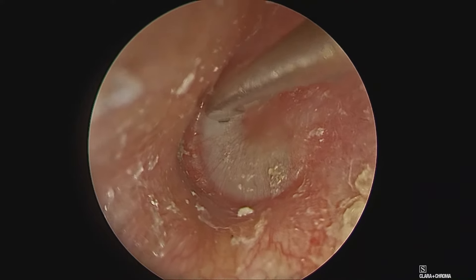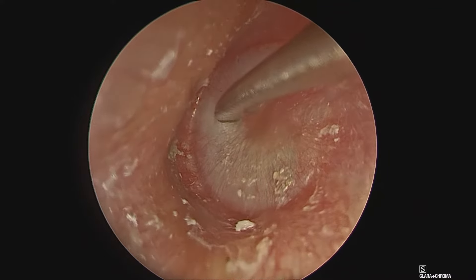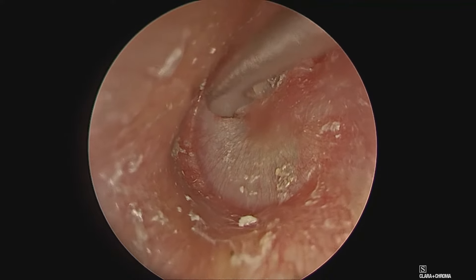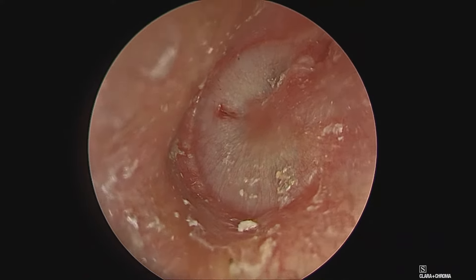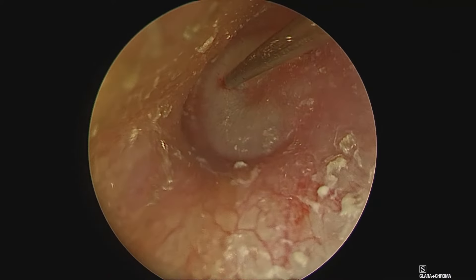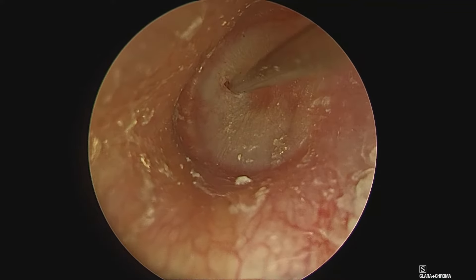You would have appreciated that the tympanic membrane was dull in picture with the absent cone of light, but here for a surprise it is a dry tap — there is no fluid on giving an incision. This happens when the patient has been taken under general anesthesia, sometimes because of pre-operative bag-mask ventilation which may have displaced the fluid from the middle ear through the Eustachian tube.